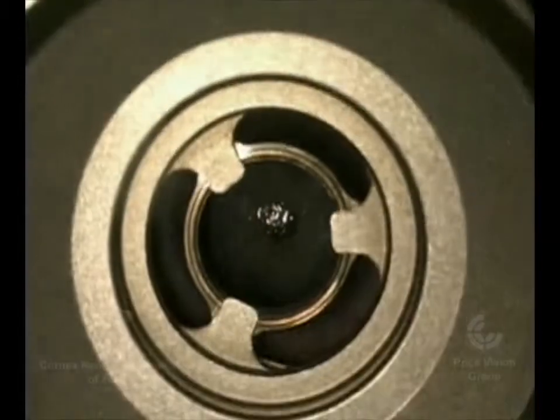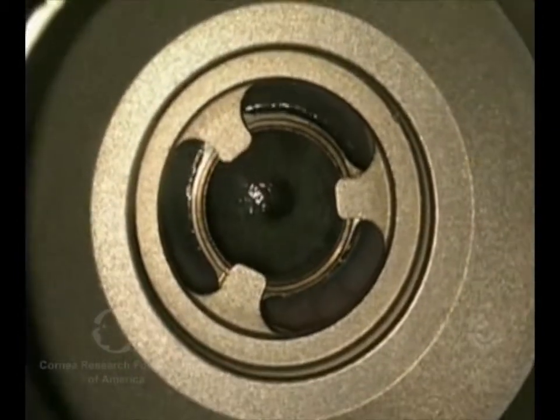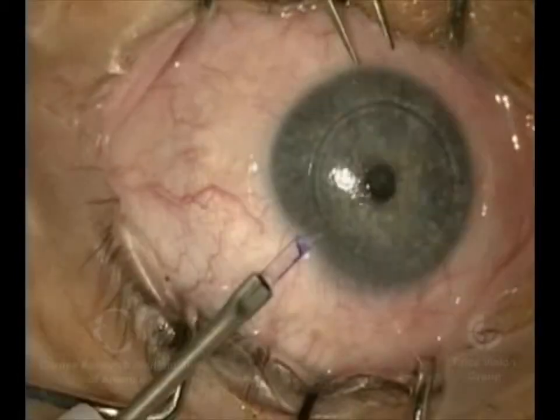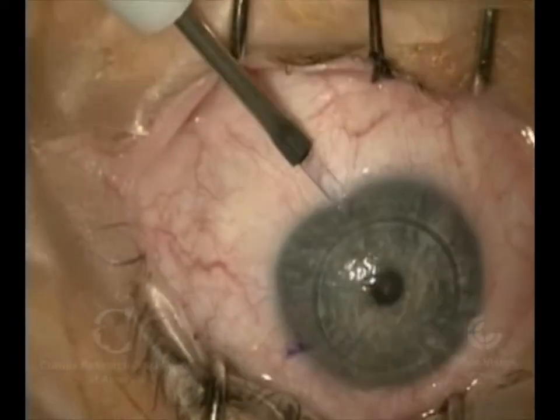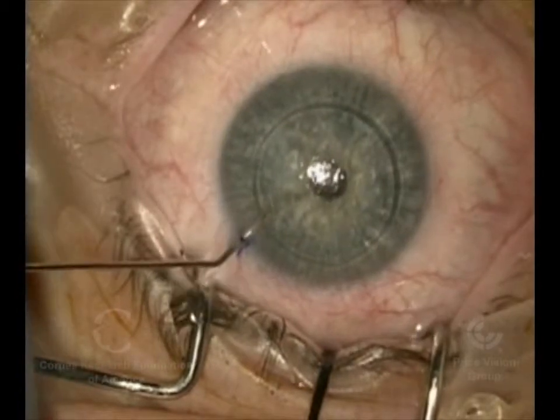Hi, this is Dr. Francis Price, and I'm going to show you the differences between doing DMEK, Descemet's Membrane Endothelial Keratoplasty, in an eye that has its own natural lens, which we're going to leave in place, and the other ones that we typically do.